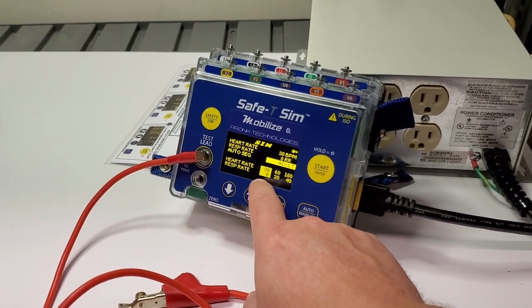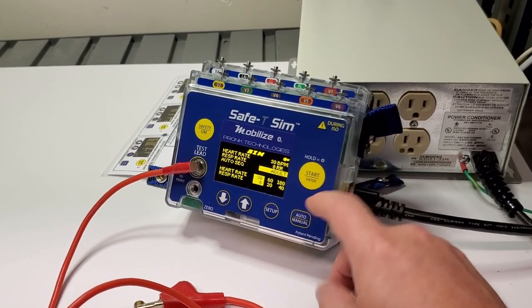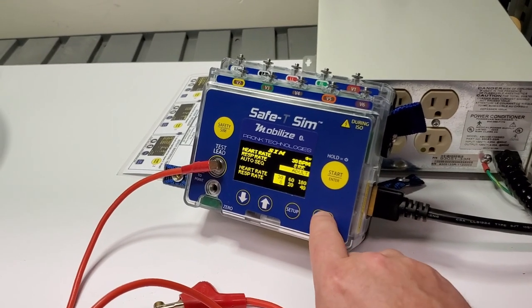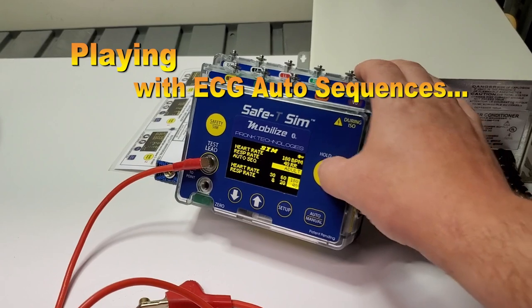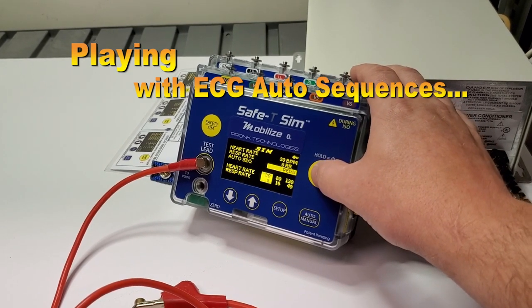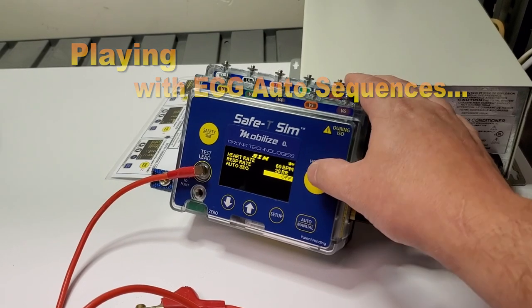You can see it starts out at 30, 8, 60, 20, 180 over 40 for respiration. I myself have not had to use that yet — it actually goes up to 220.